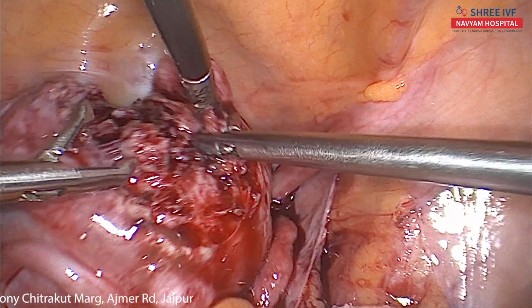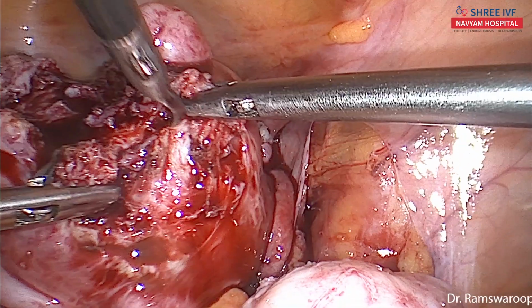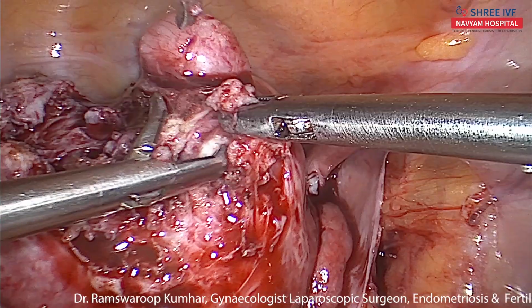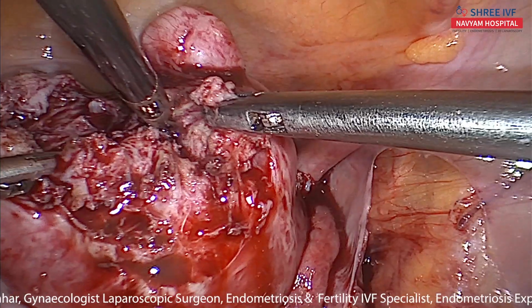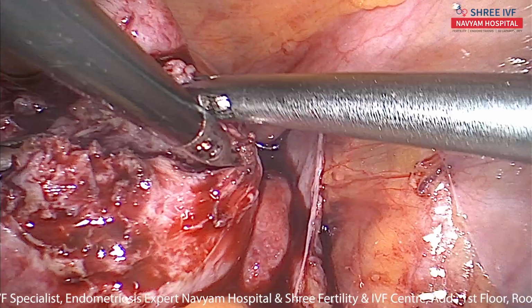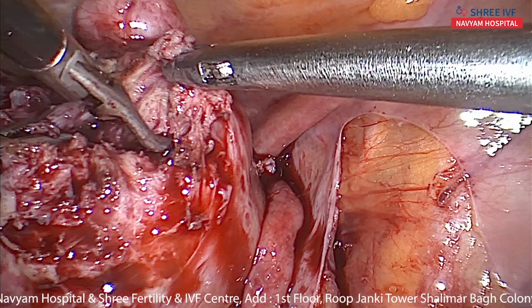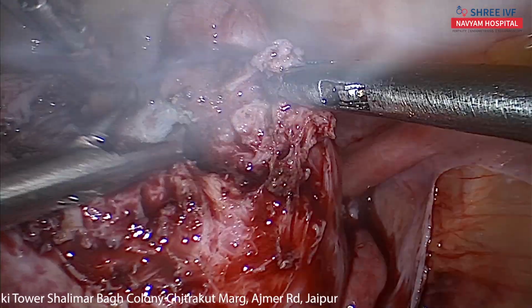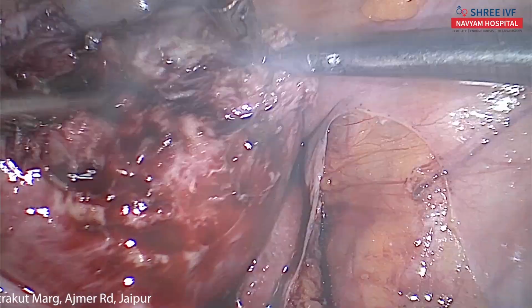Hold it. Yeah. This is another myoma which is embedded inside.